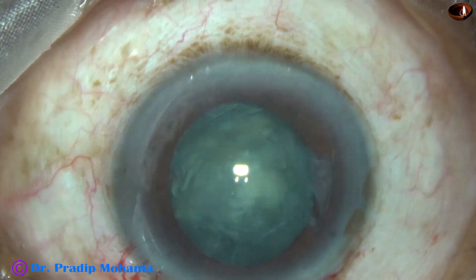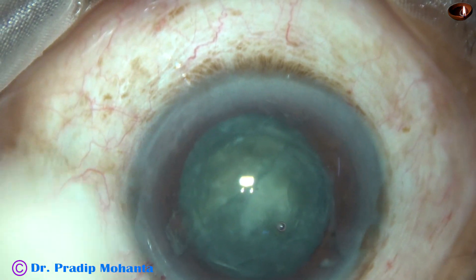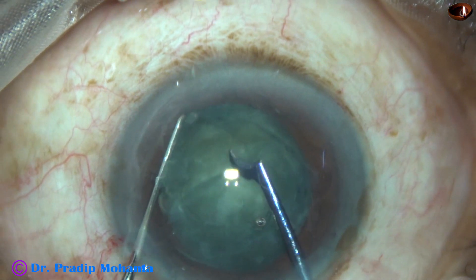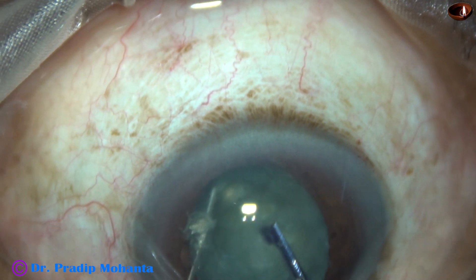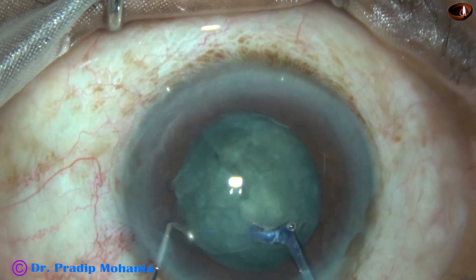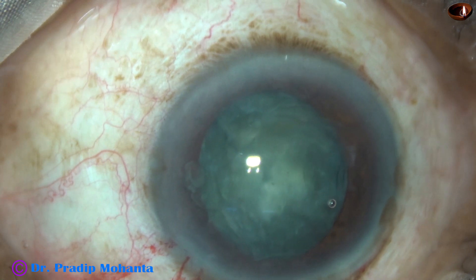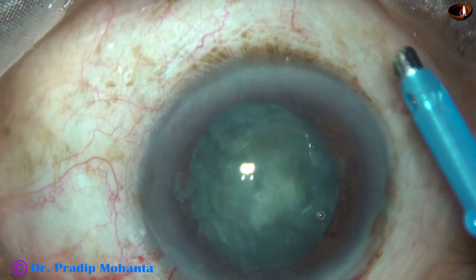Now, to see clearly, I inject visco again. Now I can see the hemi-nucleus to be chopped clearly, and I use the pre-chopper to divide this hemi-nucleus. Now the nucleus has been divided into almost four equal parts, and I'm going to consume each nuclear piece single-handedly.